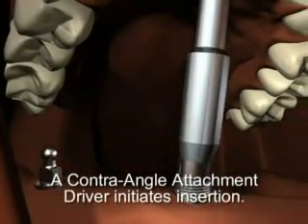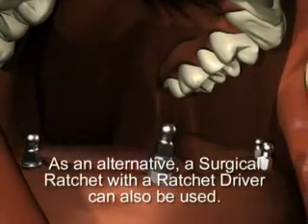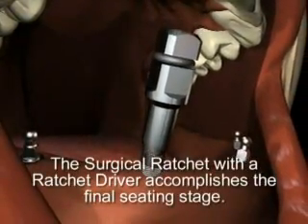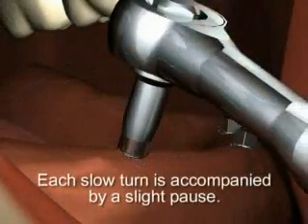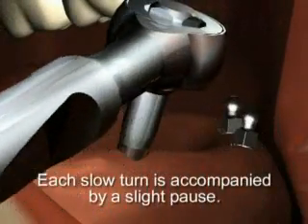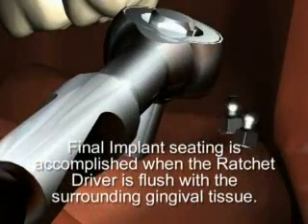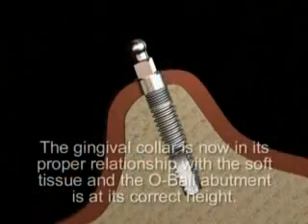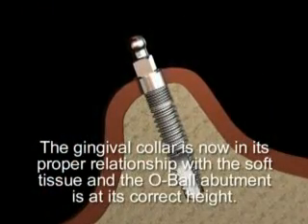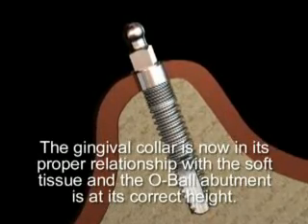At 15 RPM or less, insertion is initiated. A surgical ratchet with a ratchet driver can be used as an alternative. The final seating stage is accomplished using a surgical ratchet, with each turn accompanied by a slight pause. Final implant seating is accomplished when either the ratchet driver or contra angle driver is flush with the surrounding gingival tissue. The implant is securely in place, the gingival collar is in proper relationship with the soft tissue, and the o-ball abutment is at its correct height.